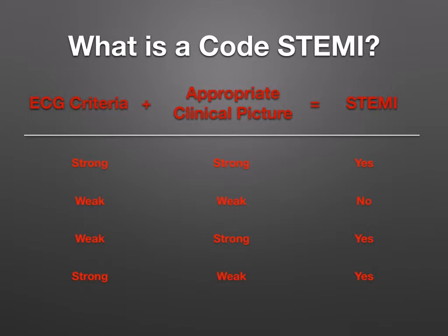Again, it's not always. There are, again, no absolutes. It's not always, but in most times, you will see that. And in the minority of STEMIs without any chest symptoms, the ECG is likely to be pretty convincing. So I'd like to spend the rest of this podcast going over some cases.